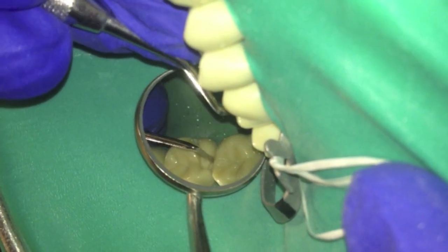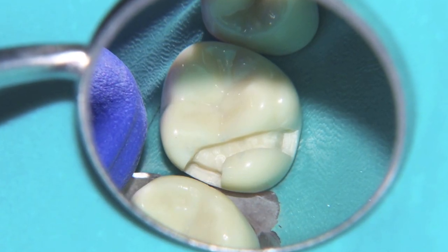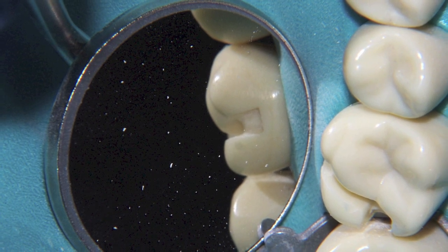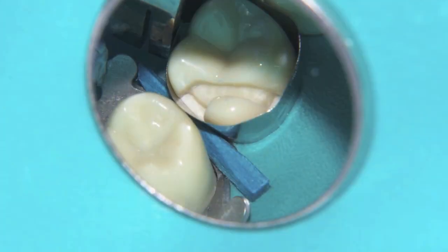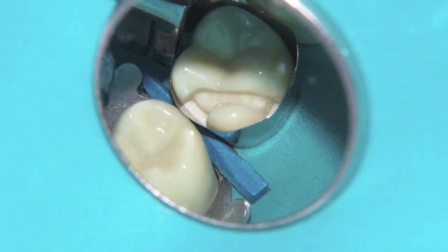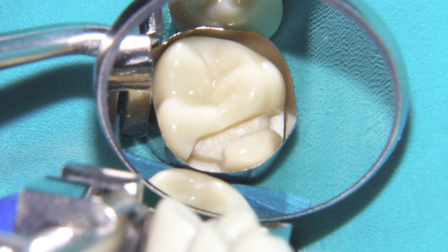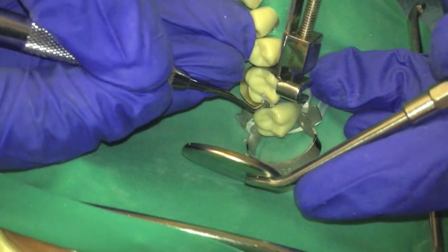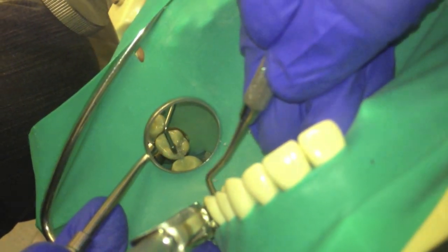The proximal box is prepared the same way as tooth number 18. Now the preparation is ready for restoration. The amalgam placement follows the same principles as previously shown.